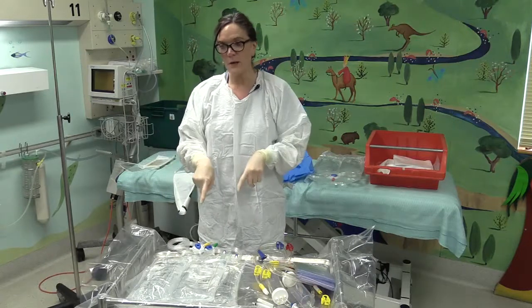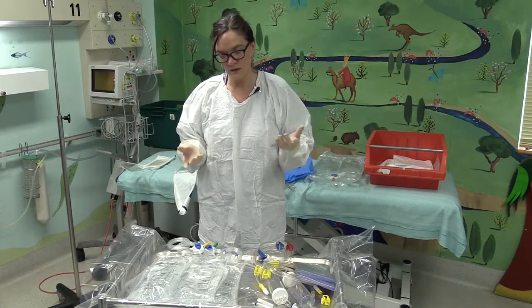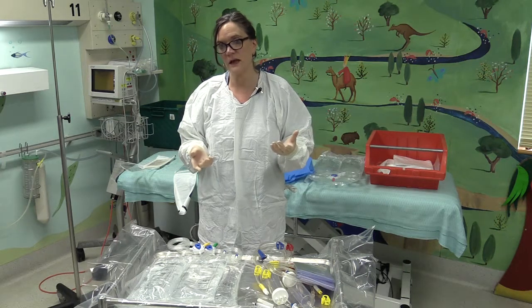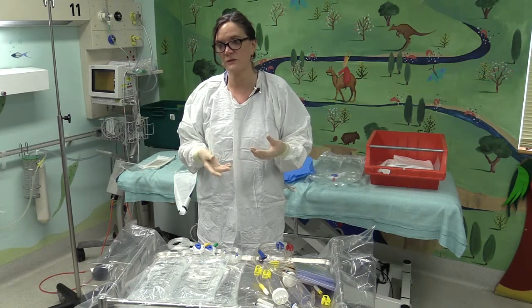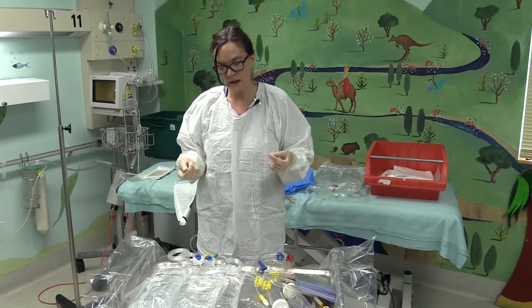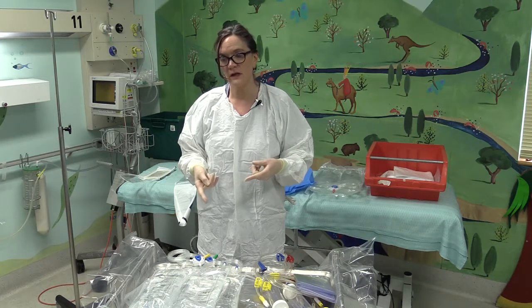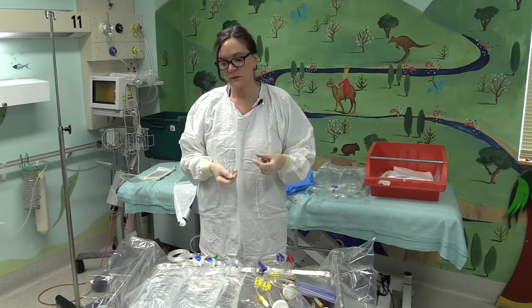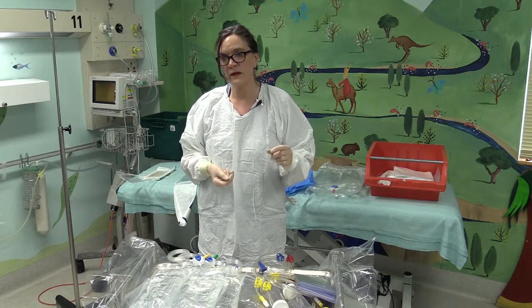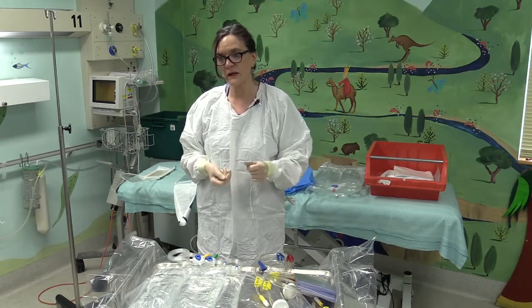Now I'm going to add heparin to the bags, because sometimes when you first insert a dialysis catheter, you have fibrin formation which can block off the catheter. So we will be adding 500 units per litre of dialysis solution. So that will be 1 ml of 1000 unit per ml heparin to each 2 litre bag of dialysis solution.